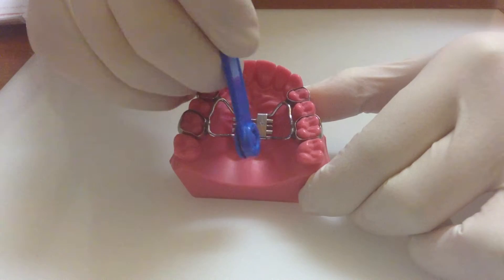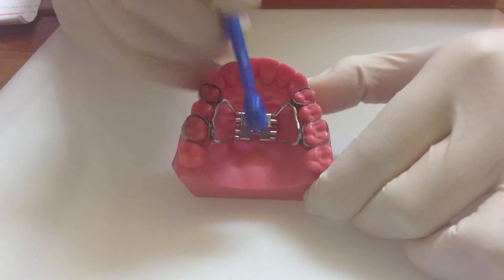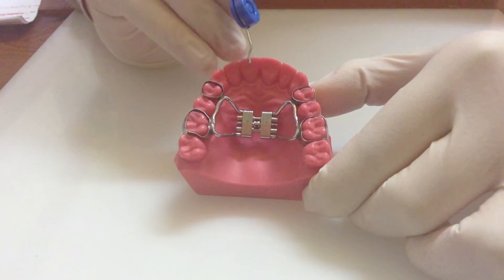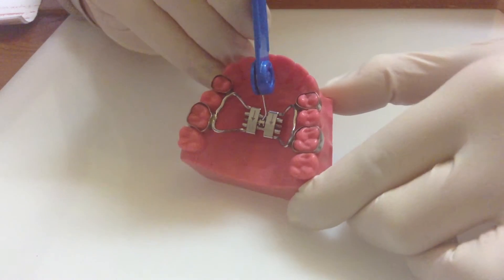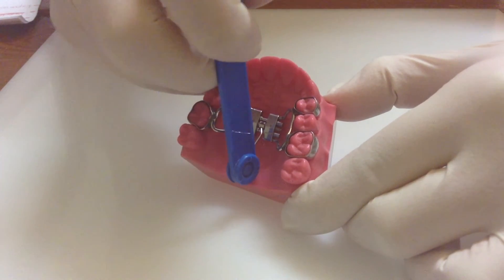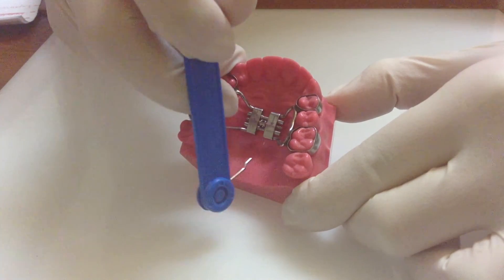A common mistake is to remove the key the wrong way, which ends up undoing the expansion. So remember: place the key into the hole, then a full rotation all the way to the back, and then gently remove the key in the correct direction.